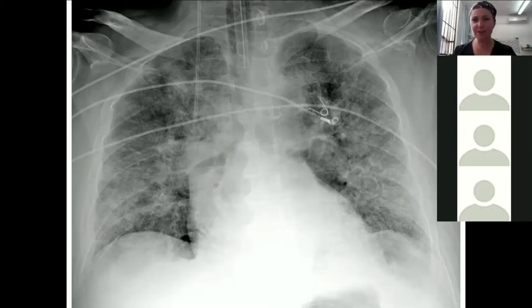And if you think about the fact that the patient's going to be on a ventilator, it makes sense that this patient's probably going to have the cassette put underneath them, and if they're going to be x-rayed from the top down, it's going to be probably an anterior posterior chest x-ray. Diaphragms look all right. And then there's just loads of extras here. So you've got some ECG leads on there, the trachea, and the patient's intubated. I can't actually see a nasogastric tube. That would be interesting. But a couple of extras going on there.